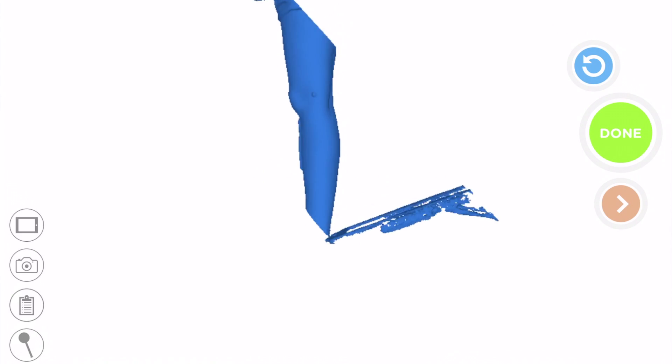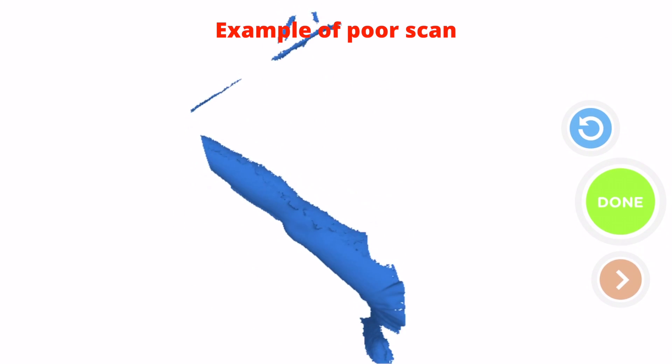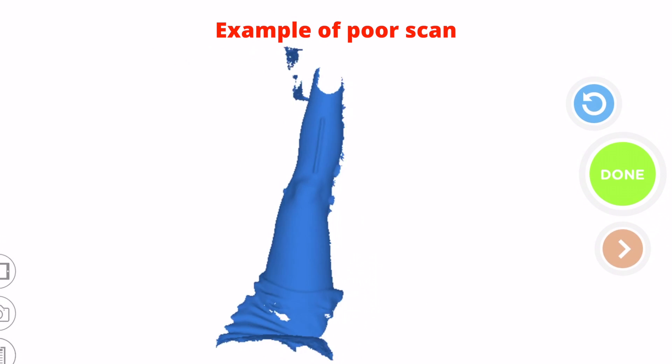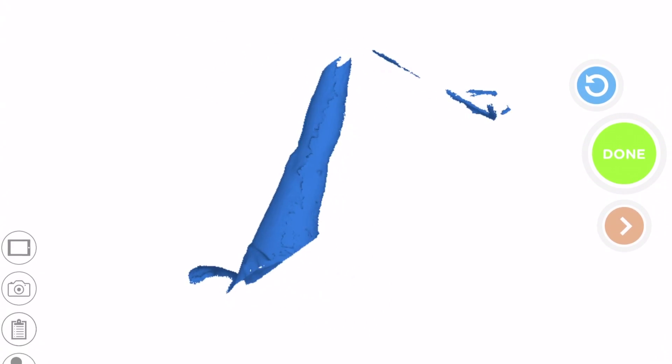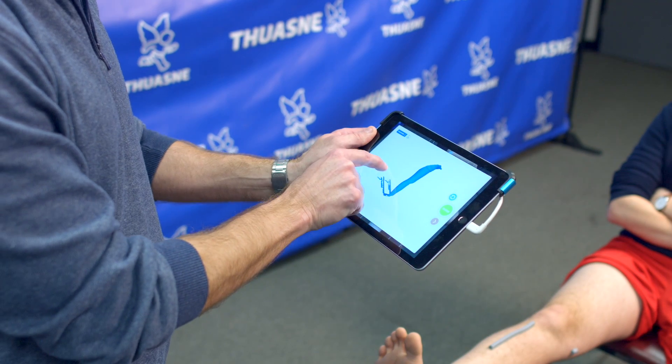If you are not confident in the quality of the scan, simply start over following the same steps. Any scan where part of the anterior aspect of the leg is missing will be rejected. Any scan where more than 50% of the posterior aspect of the leg is missing will also be rejected. Review your scan in full from a 360-degree perspective.